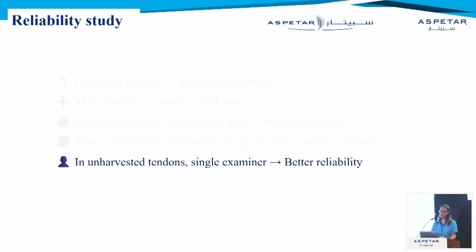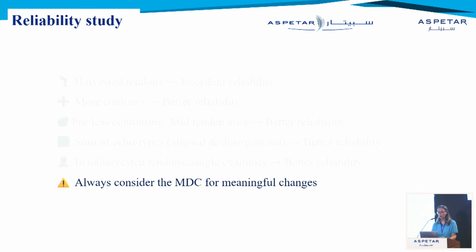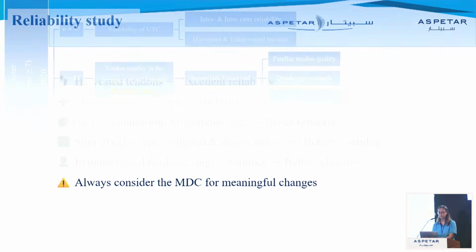And in unharvested tendons, a single examiner showed much better reliability than inter-examiner. Always consider the minimal detectable change for meaningful changes.